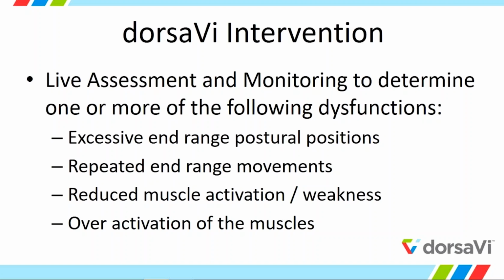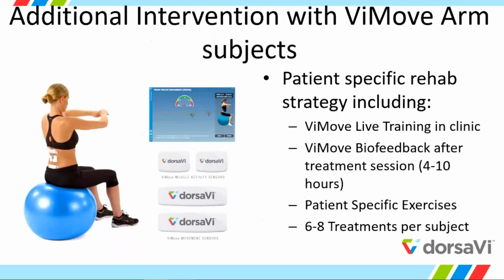So the subjects that were in the V-Move study, or the dorsaVi, using the actual system, could decide how they treated them, but it included obviously live training in the clinic, V-Move biofeedback. So each of the patients had biofeedback on for 4 to 10 hours. So they kept the sensors on for 4 to 10 hours after their treatment session. They were also given specific exercises, and those were seen for 6 to 8 treatments.